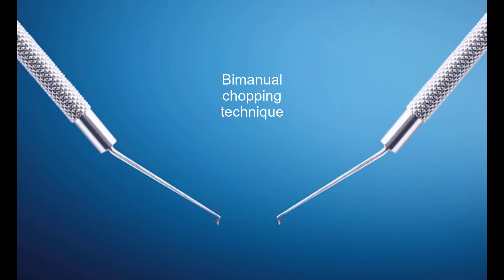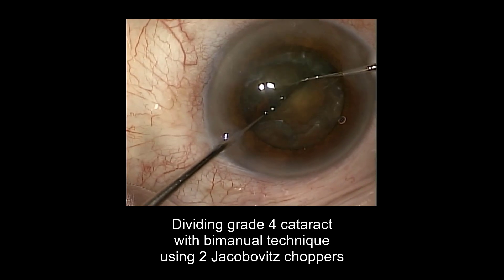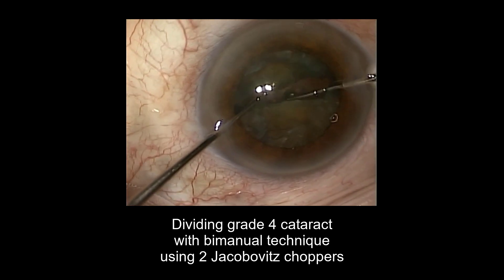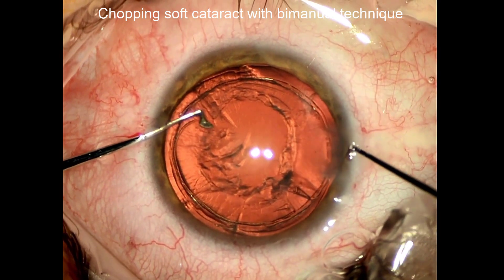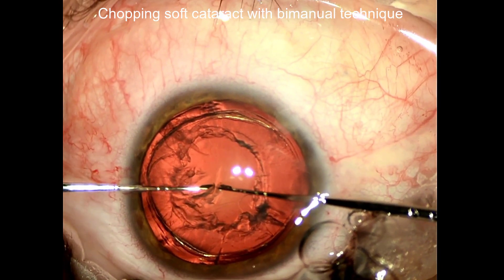The B-manual chopping technique. Dividing a grade 4 cataract with B-manual technique using two Jakubowicz choppers. Chopping a soft cataract with B-manual technique demonstrating easy lateral division.